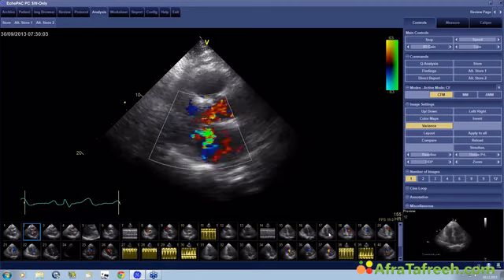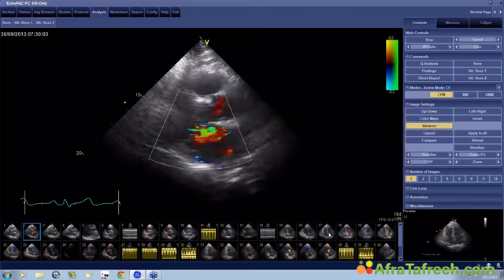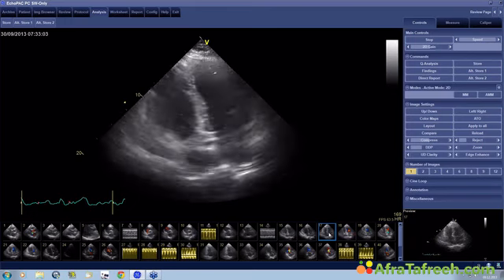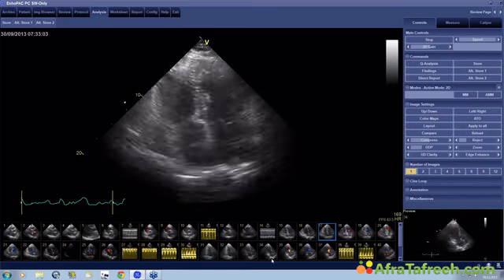Remember, not all of our patients have terrific image quality, and I want to show you the cases how they really present in clinical practice and show you the advantages and disadvantages, and up front also show you how we can still solve problems even if we don't have such good image quality.